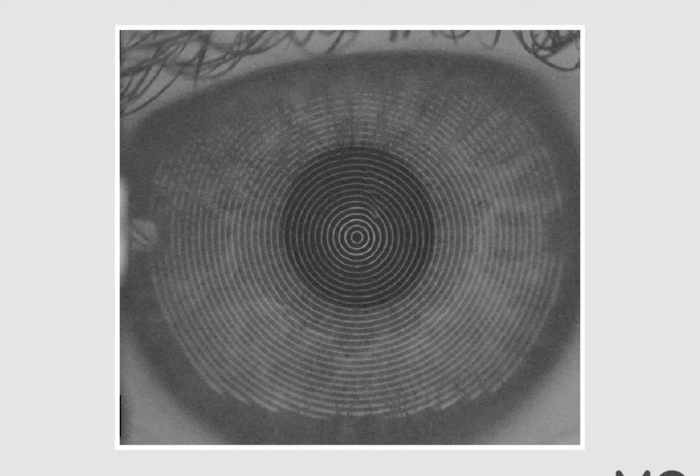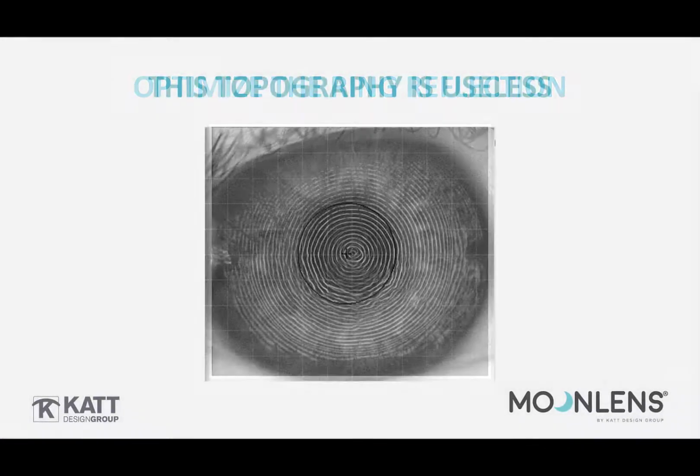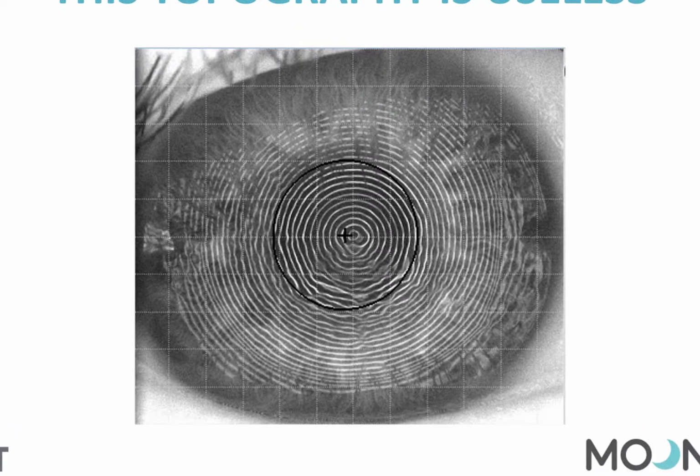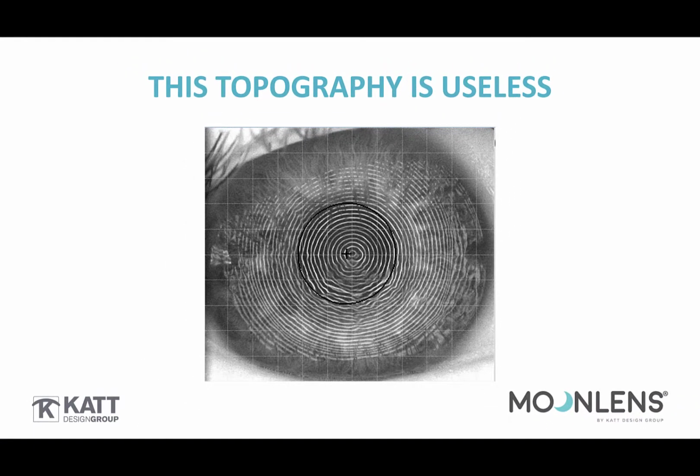In placido topography, the central rings are the most important for constructing an accurate determination of the eye shape, power, and elevation. In this map, the patient had severe tear film breakup at the moment of capture. Ask your patient to blink regularly to ensure an optimal reflection off the tear film. In cases with immediate breakup after the blink, instill artificial tear prior to mapping.